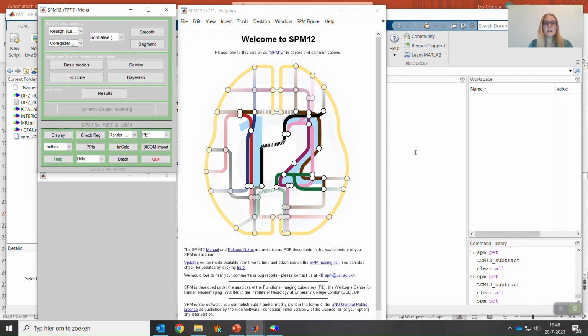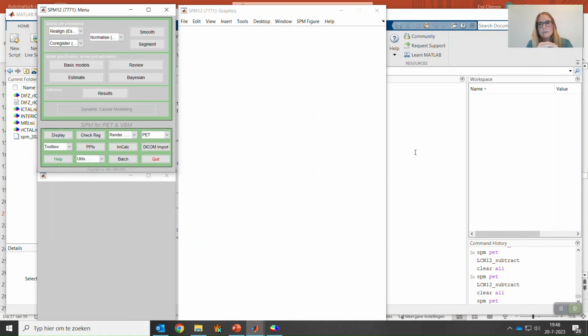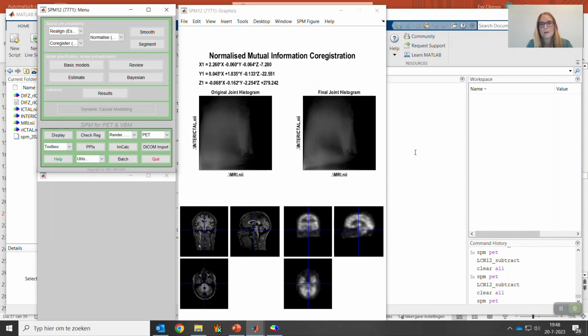So in theory, all these steps could be automated instead of doing it manually step by step. If you would automate it, you have to be aware and be very consistent in checking the in-between steps and the in-between output images. In our center, we generally have one interictal SPECT a week.